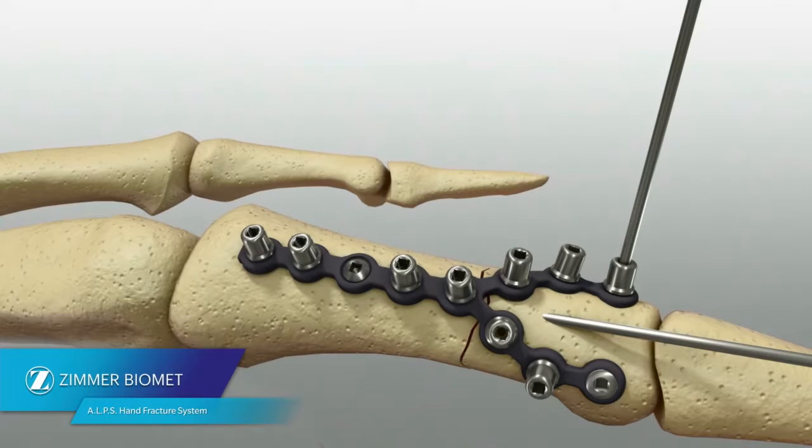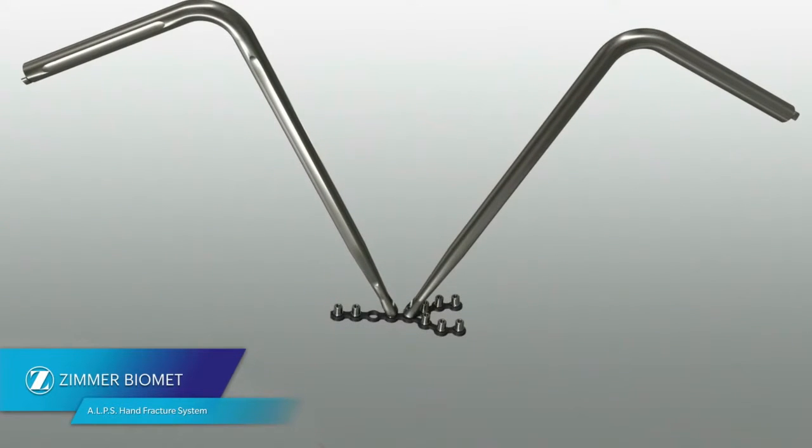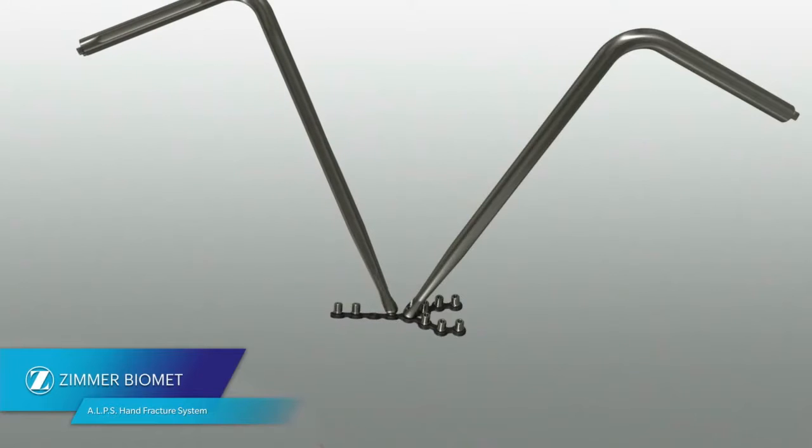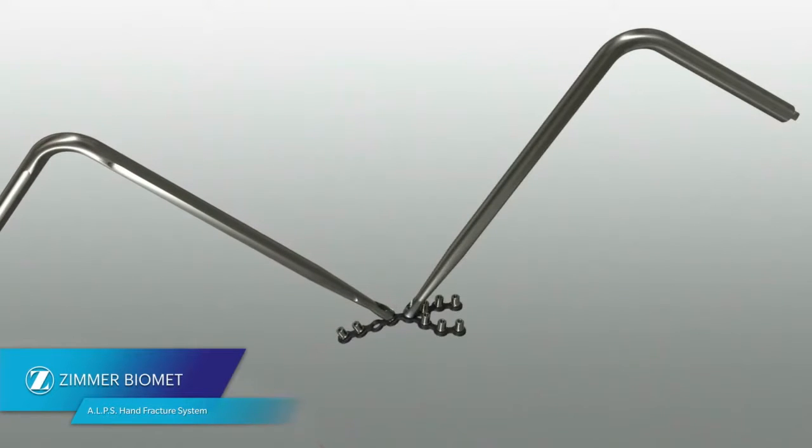Throughout the application, the plates can be bent, twisted and curved in situ, utilizing the plate benders. For axial and coronal bends, place the long end of the benders over or into the fast guide inserts of adjacent nodes.